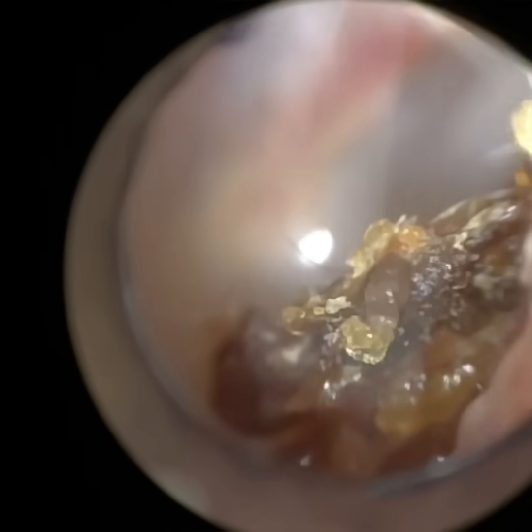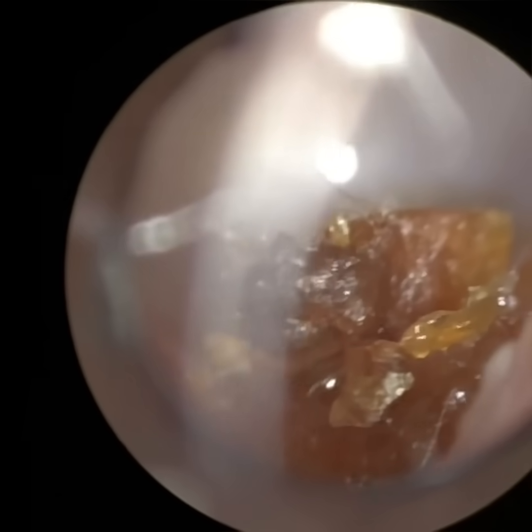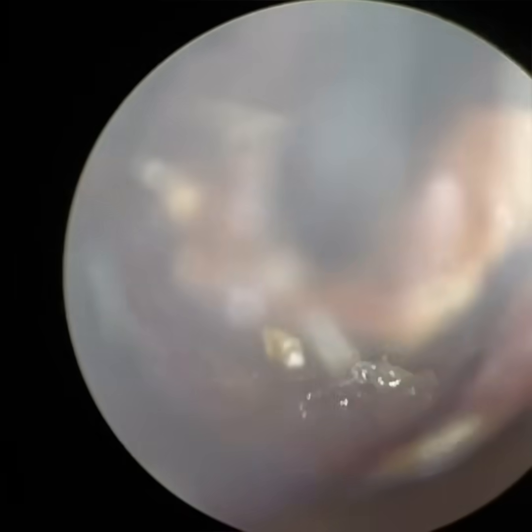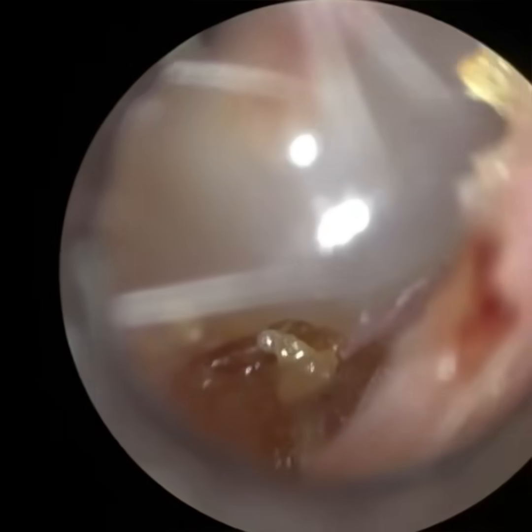And again, there's a comment left by a fellow colleague, and it was more of a point of view they mentioned. It wasn't criticism, but they don't use the endoscope because they said they experience a lag. So the image on view is somewhat delayed. It's not real time, which I was quite surprised to hear. And this is where the problem lies. There's a lot of people providing training or equipment who are not really in tune with the training and equipment themselves, and the equipment is not always great. So I questioned why they were getting this lag, because I've never experienced that. And I think I know why.